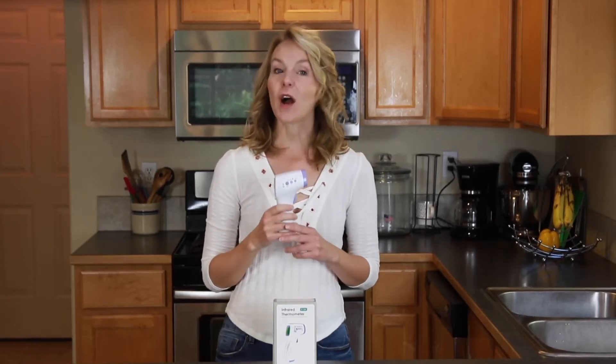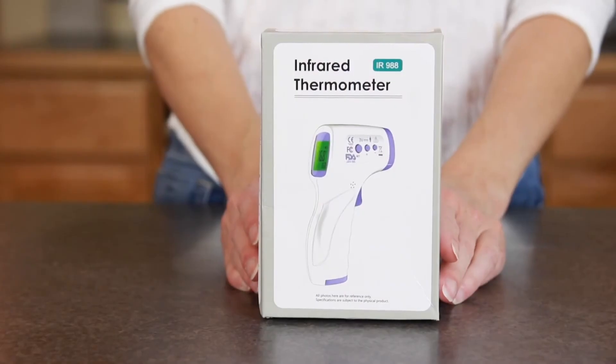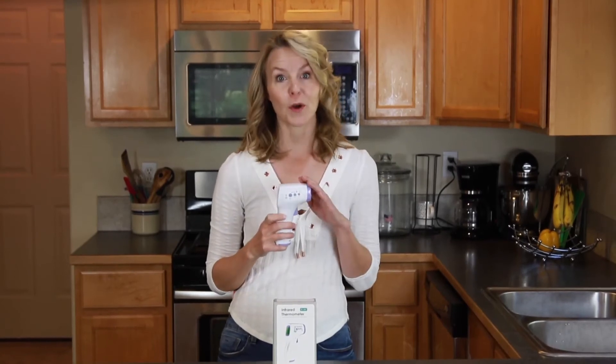Hi, I'm Faye and this is the No Contact Infrared Thermometer from Pure Thermo. We're all concerned right now about staying healthy and protecting our businesses and our neighbors. The Infrared Thermometer from Pure Thermo takes your temperature in as little as one second.